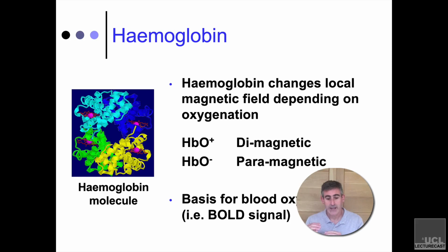So in other words, when there's oxygen that's being used from these hemoglobin molecules, that causes a little bit of distortion. There's a decrease in the signal that you see. So this is what we mean when we talk about blood oxygen level dependent. The level of oxygen in the blood at a particular point in space means that you have greater signal than if you have less oxygen in the blood at that space. Because if you have less oxygen, the lack of oxygen means the iron molecules in the hemoglobin are distorting the local field. Okay?